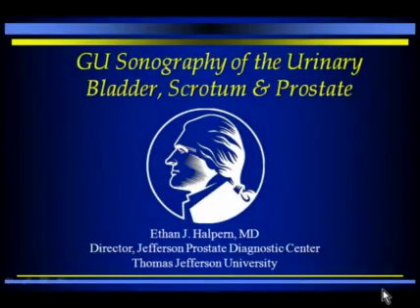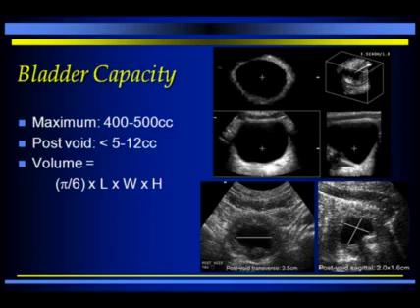So we're going to speak today about sonography of the urinary bladder, the scrotum, and the prostate. And we're going to start off with the urinary bladder. As you probably know, the urinary bladder's primary function is to serve as a reservoir for the urine so that you can accumulate the urine and then urinate at one time and then accumulate more urine.